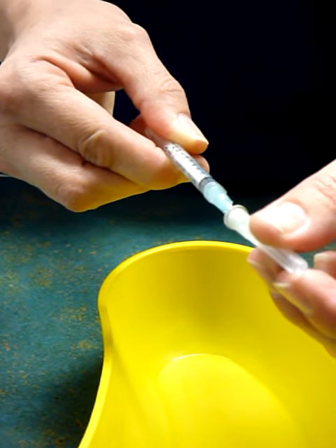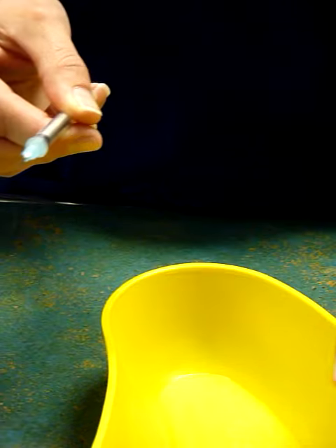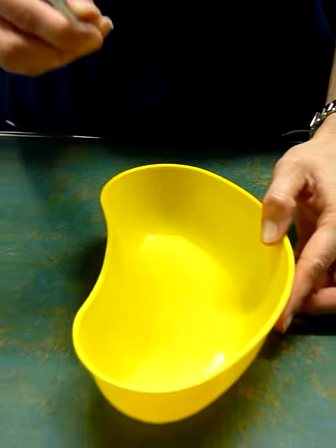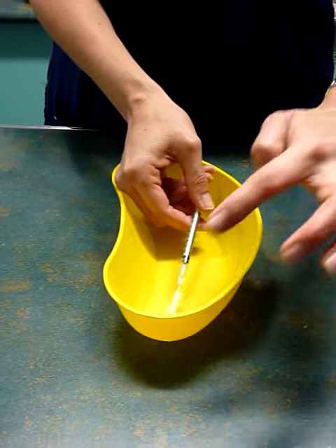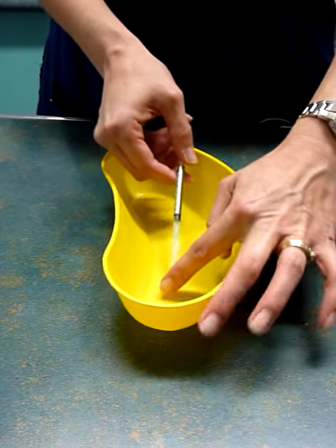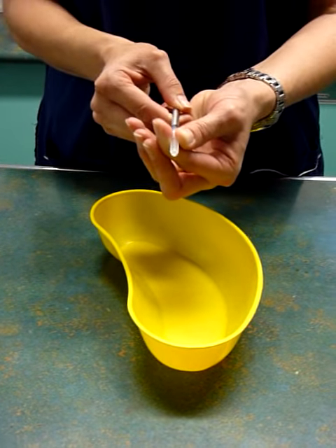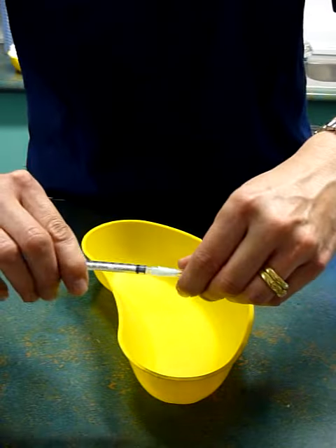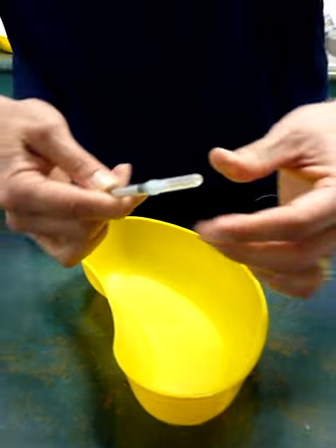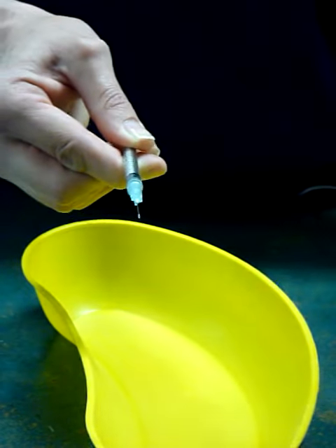Sometimes you need to replace the cap. In which case, pop the cap into the kidney dish. Place the end of the needle into the end of the cap, then place your finger on the end of the cap to push up and into place, to ensure no needle stick injury.